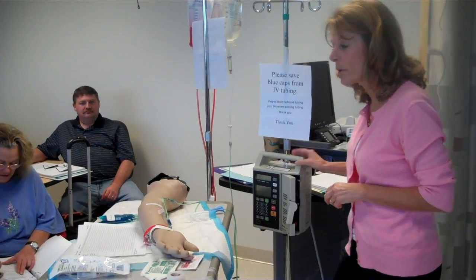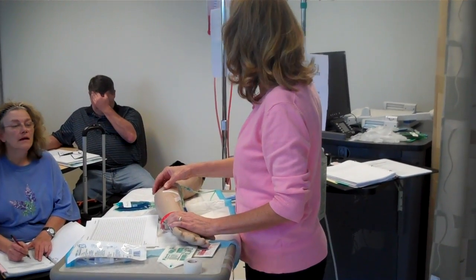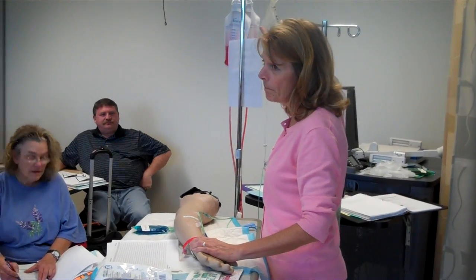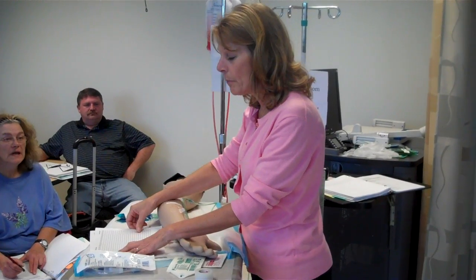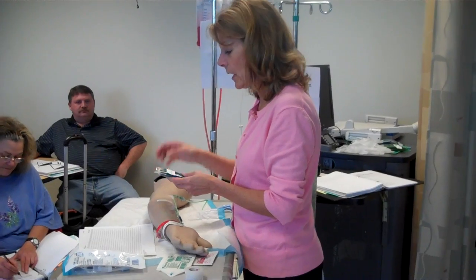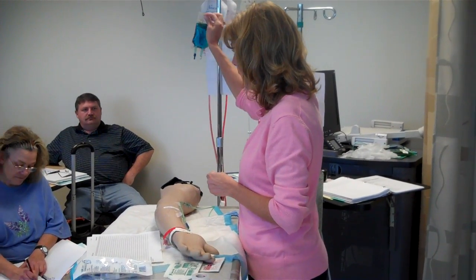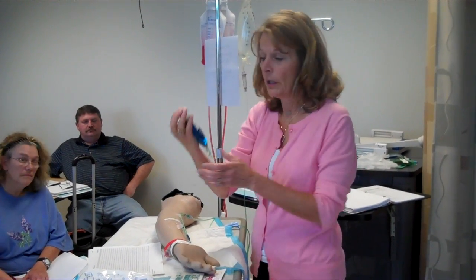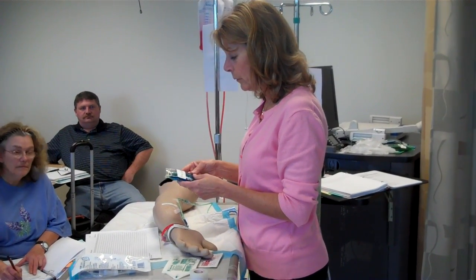Let's go ahead and check our order. My order says I'm working with John Jones here, and his primary bag is 0.9 sodium chloride. Alright, and that's going at 125. And now I have to give him ampicillin, and it's 250 milligrams, and it's in 100 mils, and I have to run it over 20 minutes.